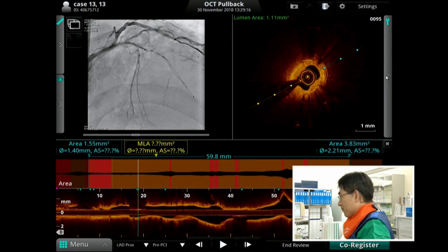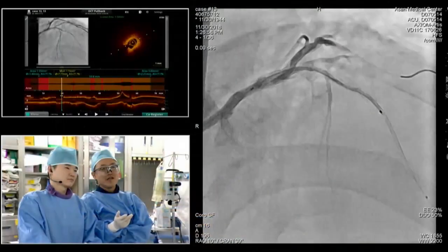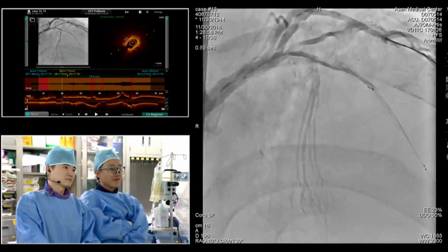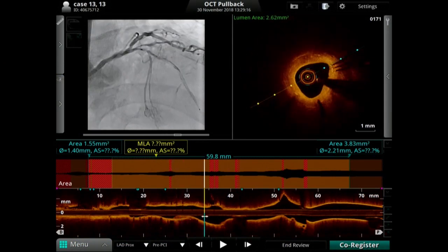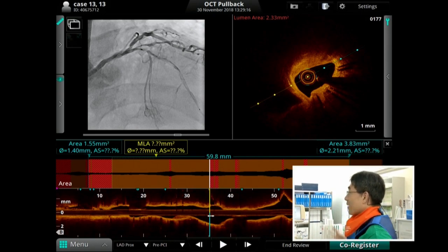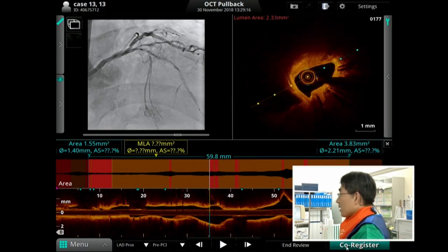Dr. Kim, is there any neoatherosclerosis finding, or some calcified finding? This kind of finding is a possible neoatherosclerosis. There is possible macrophage inflammation, or some low attenuated plaque and calcification here. So I think some neoatherosclerotic findings are possible. We can do balloon angioplasty in this case at first, and then if it's not adequate, we can do another measure. But I think the main mechanism is underexpansion, so we need to expand the stent first. The stents were 2.5 and 2.75 in the distal part.